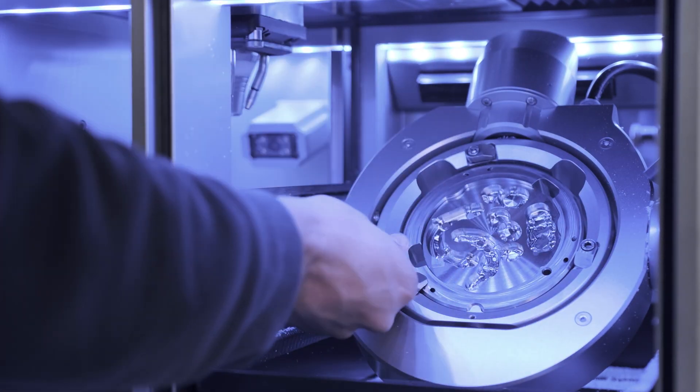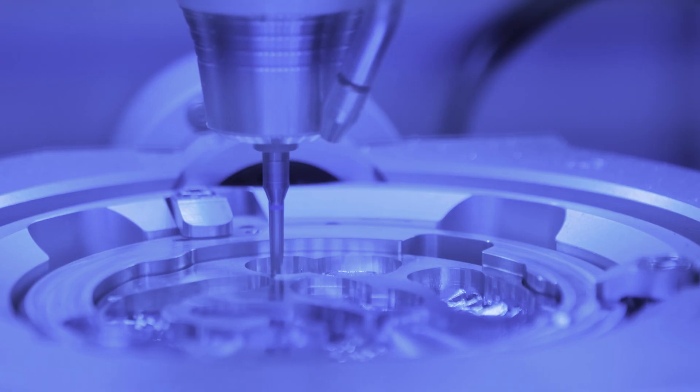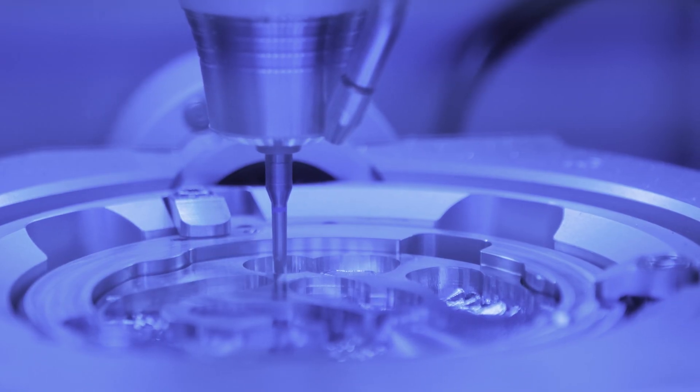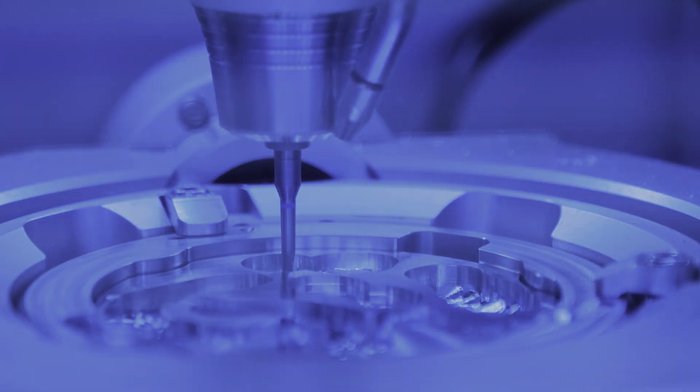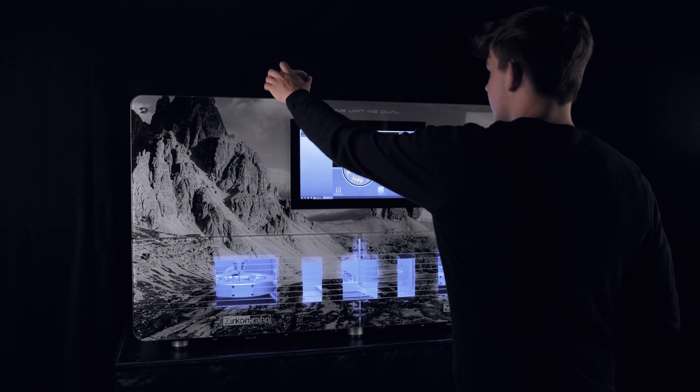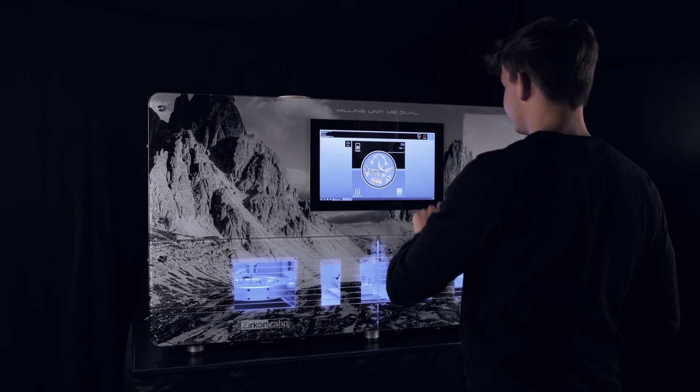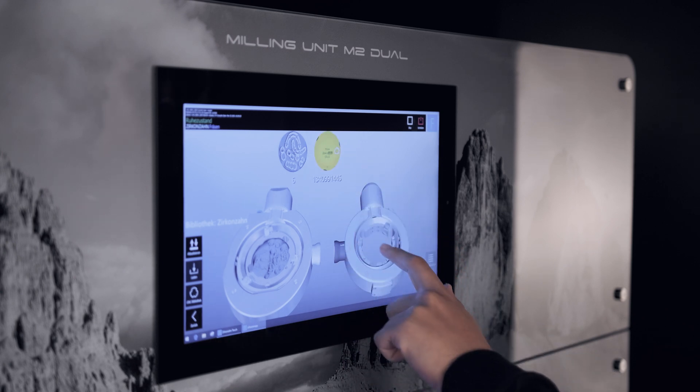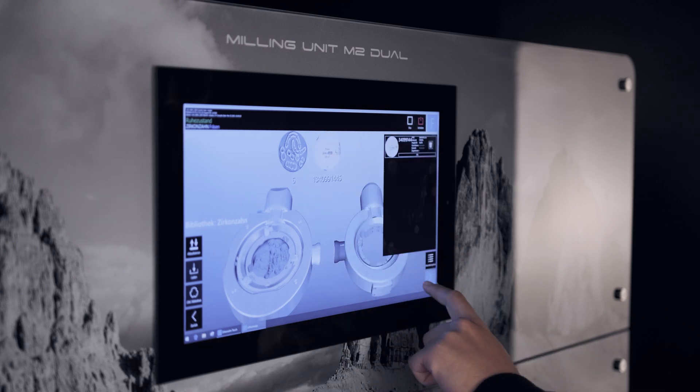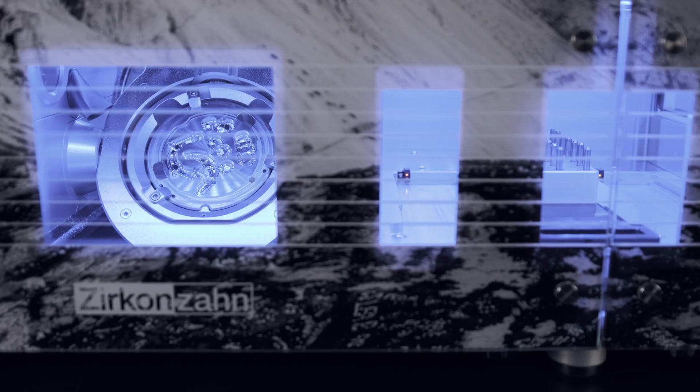The M2 Dual telescope or milling unit is equipped with two separate milling chambers. This makes it even easier to stop one process in order to begin another one. In this case, you can stop a milling process in one chamber and start a new one in the other.